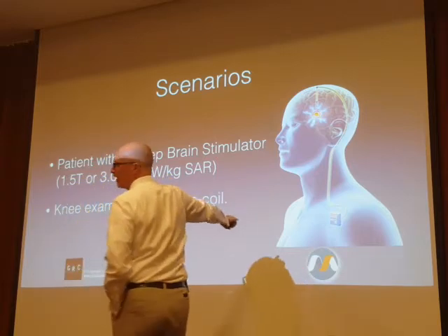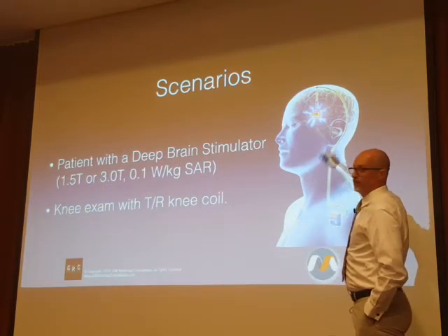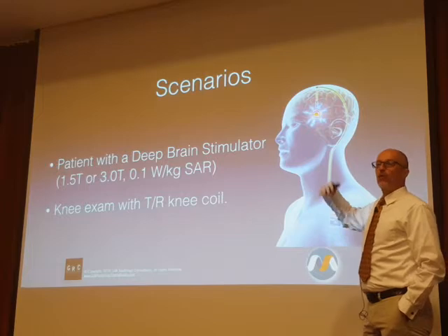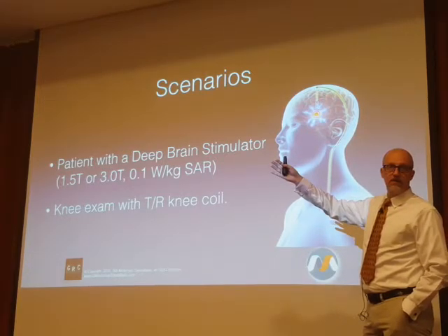If we put this patient in feet first to image the knee, as opposed to head first to image the brain, are we exposing them to a different quantity of static field? Yes.